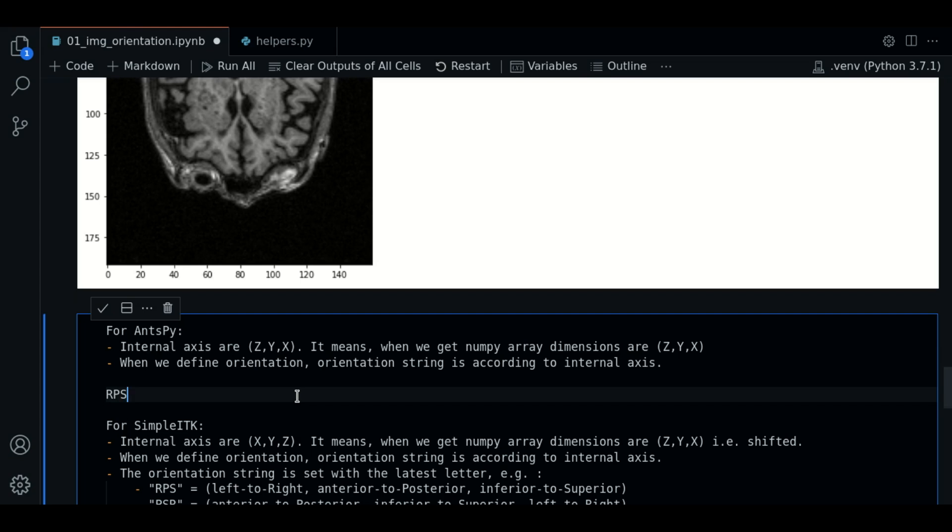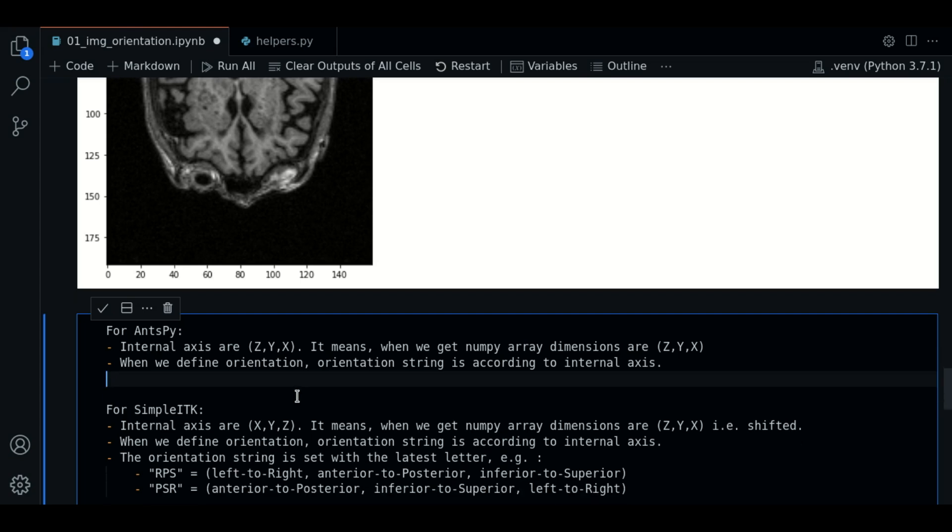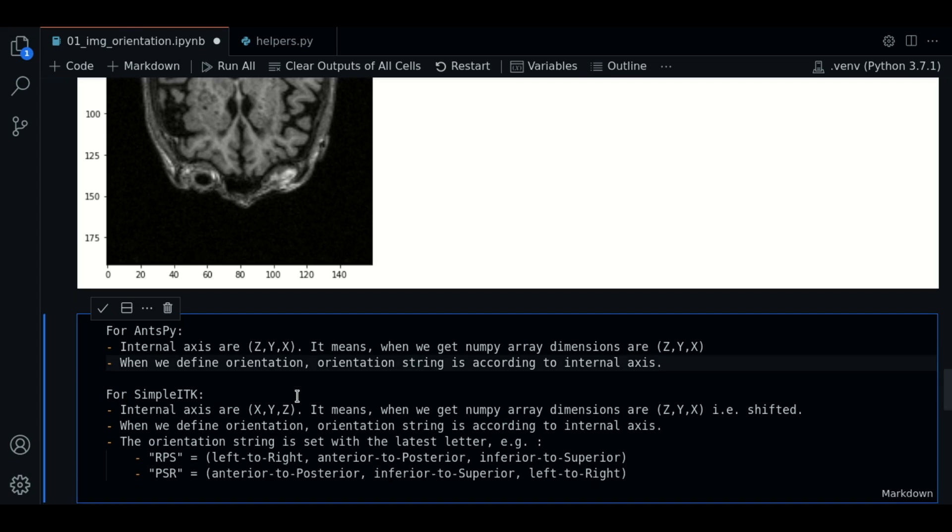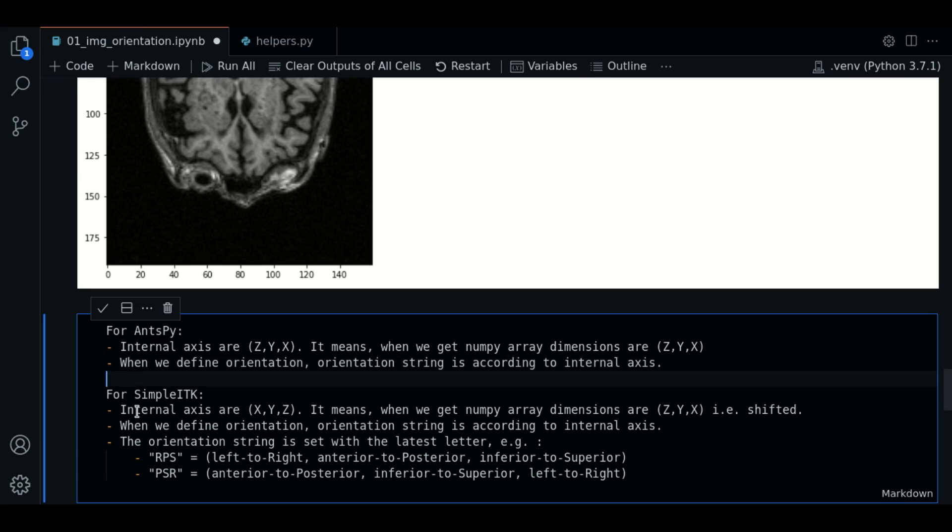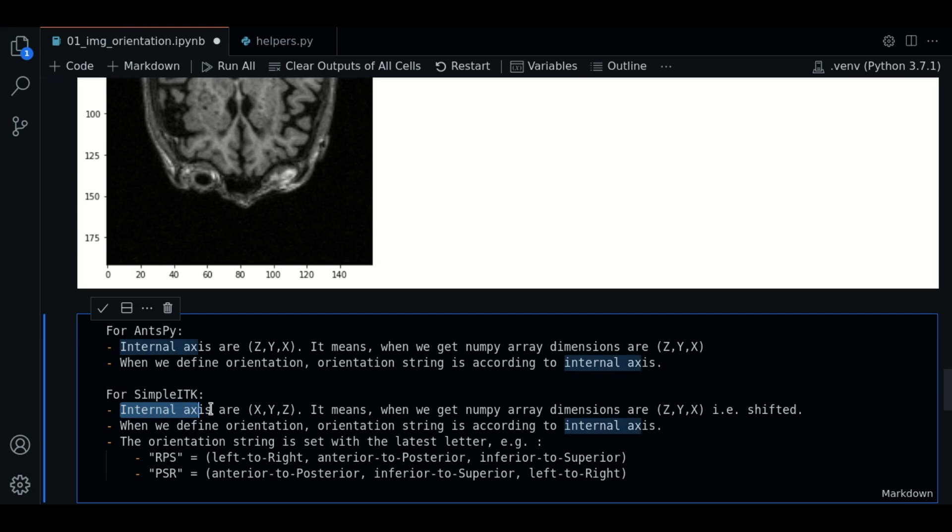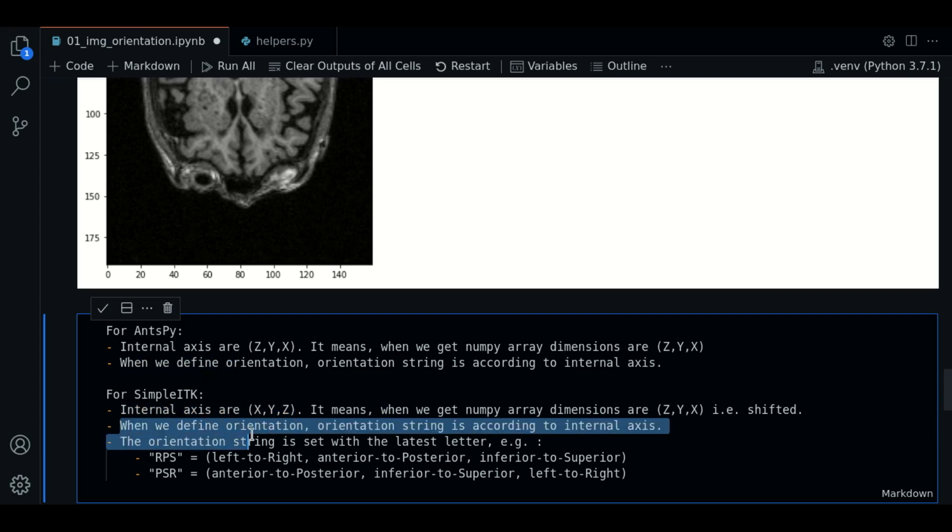But for Simple ITK, things change a bit. So for Simple ITK, internal axes are X, Y, and Z. This means that the array dimensions are shifted now.